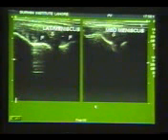We also look for menisci. You can get some weight lifters in which you will have meniscal tears. Here is the lateral meniscus and the medial meniscus. The patient was a weight lifter having pain while walking, and there was a small tear which was confirmed on MRI.